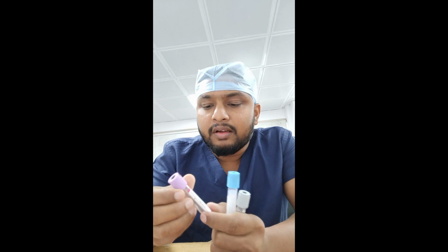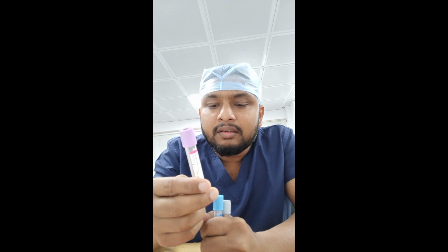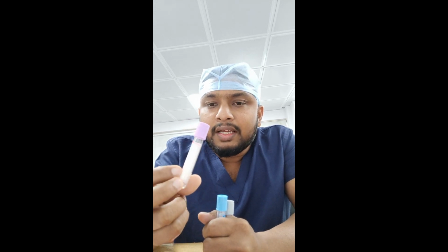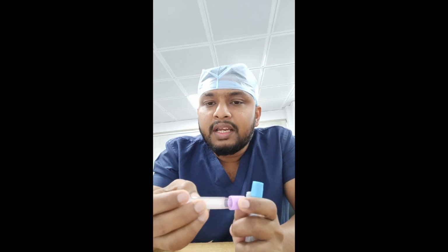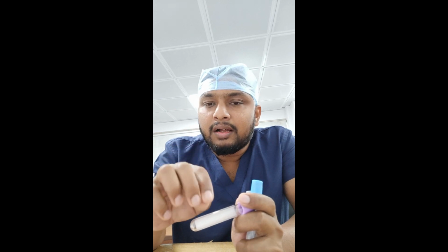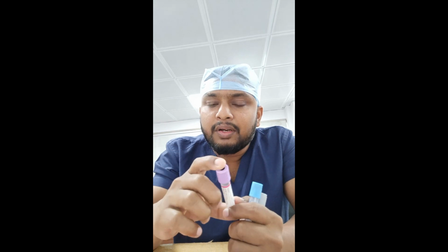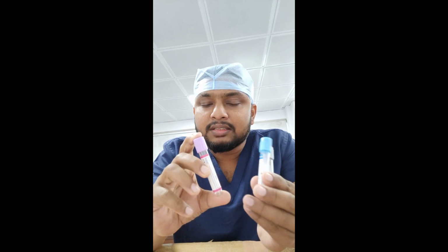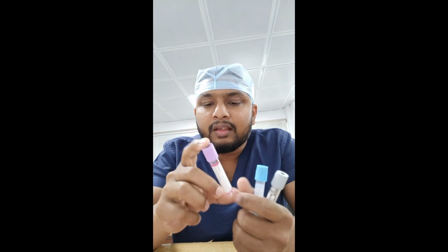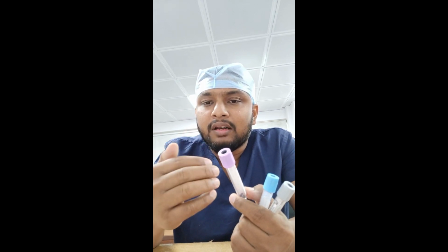Next comes the EDTA Vaccutainer. In the EDTA container, the purple container, you will take a blood sample of 3 ml, and a substance called EDTA is present in it. It will mix with the blood. After taking the sample, you need to shake well. For all these containers, after taking the sample, you need to shake well. Then the product in the tube mixes with the blood and it will not clot.